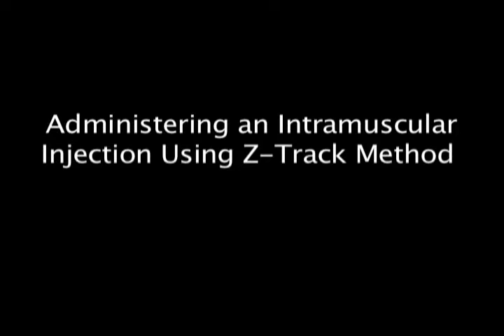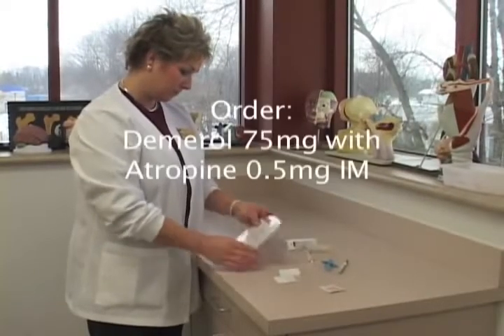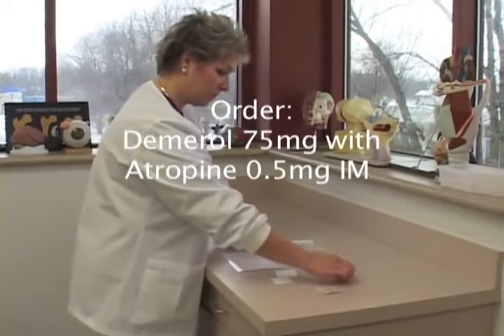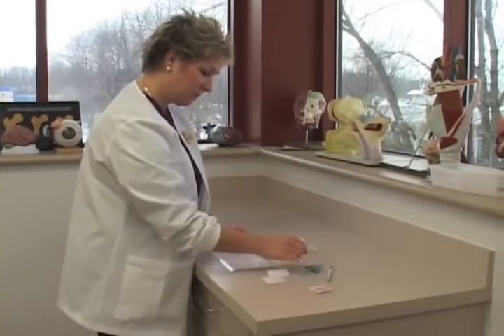Administering an intramuscular injection using Z-Track method. Check physician's order and assemble equipment. Calculate the correct dosages. Wash your hands.